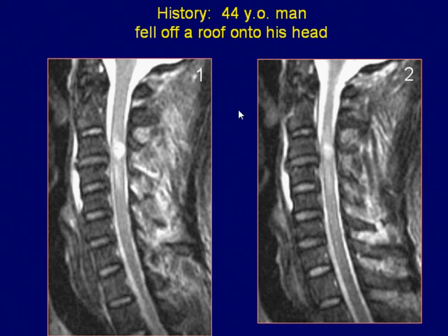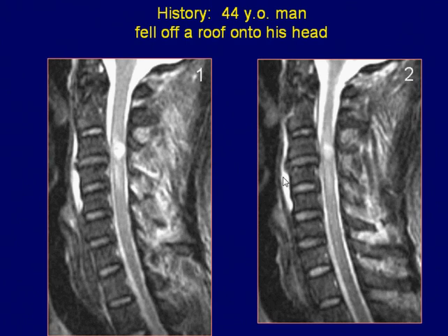A 44-year-old man with a history of trauma. Sagittal T2-weighted images of the cervical spine demonstrate a hyper-intense lesion in the spinal cord from C2 to C5 level. High signal is also seen in the region of the interspinous ligament posteriorly and the pre-vertebral region anteriorly.